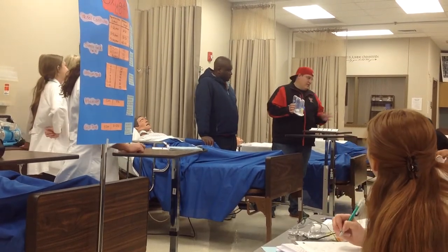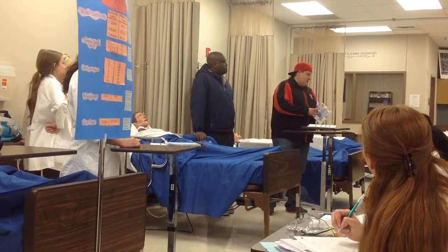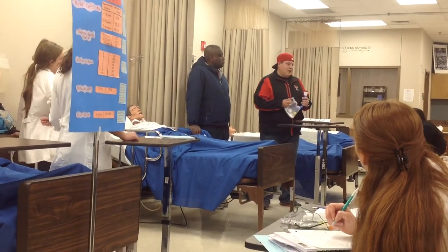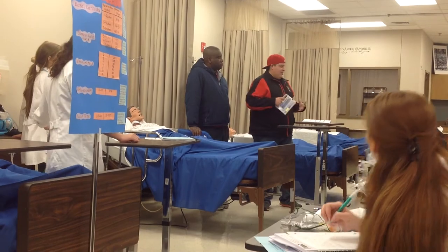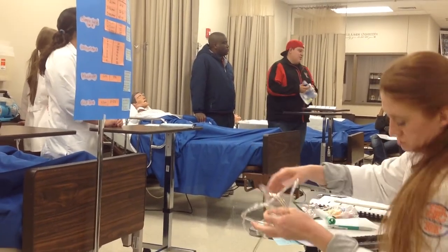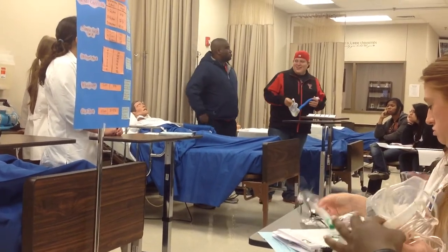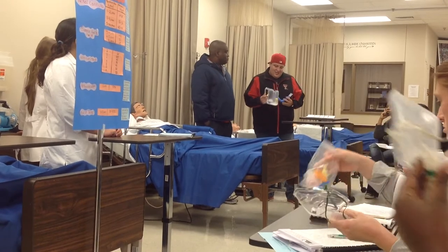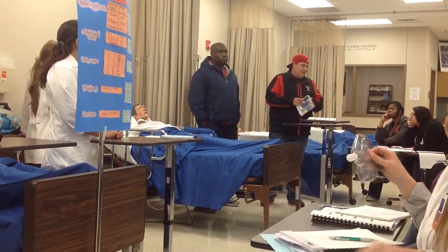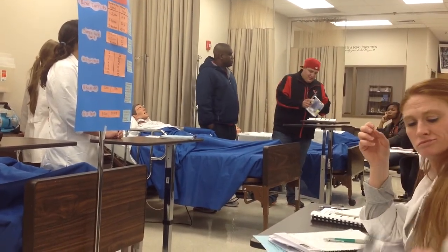Say you get it to 2,500 before you go in. You do it again. The doctor tells you how often to do it. Usually it's about every hour, on the top of the hour. They just want to make sure your alveoli are opening, to prevent pneumonia, so it'll help you keep breathing and prevent further complications. They do this before and after surgery. Just repeat it, and make sure you take your time between breaths, so you don't pass out after doing it like 20 times.